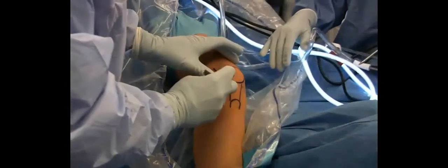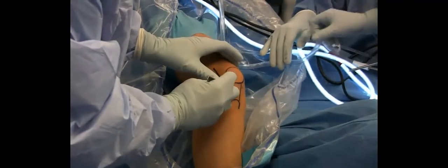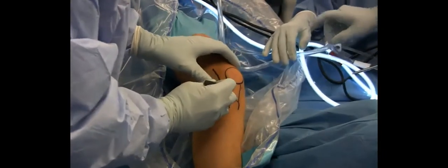We then perform a standard diagnostic arthroscopy using anterolateral as well as anteromedial portals.